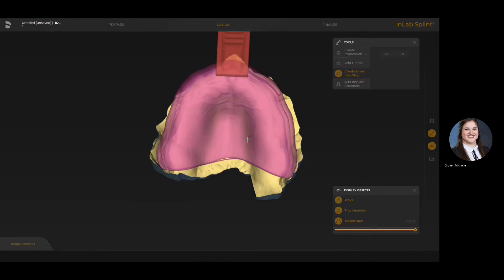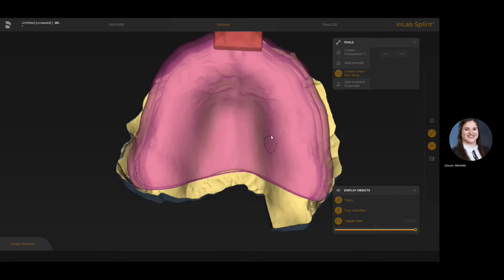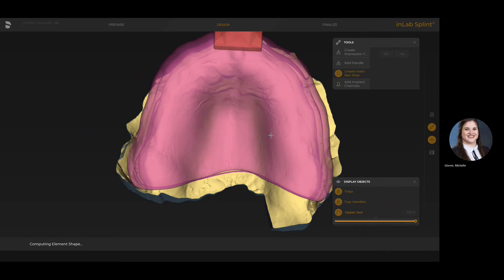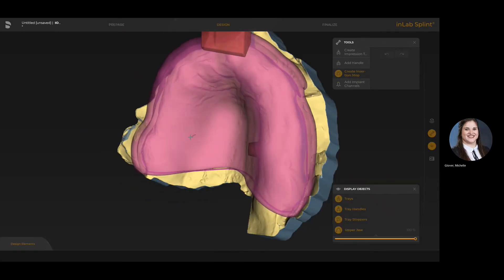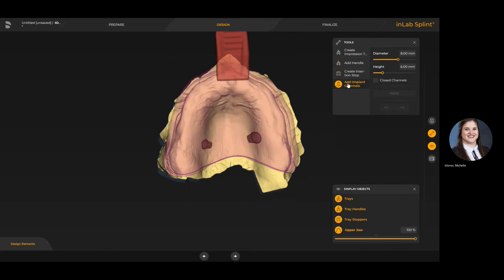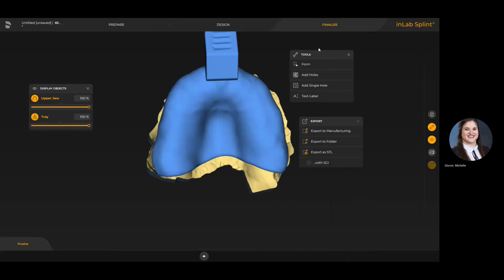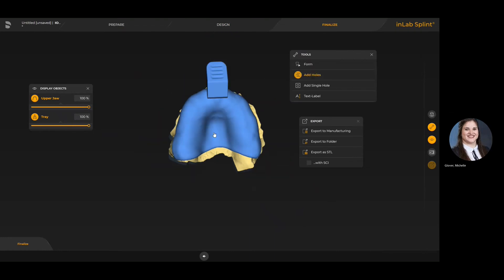For the create insertion stop — also known as a tissue stop — you double click to start and double click to finish. If you get an error it usually means you didn't have a clean connection between the starting and finishing point of your margin, so just redo it. For adding implant channels, if this was a pickup tray the tray goes translucent so you can see below to your implant sites, and you can control whether it's an open or closed tray.